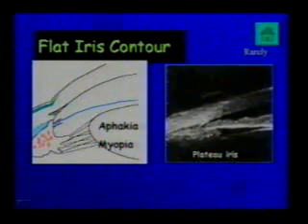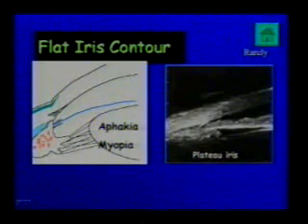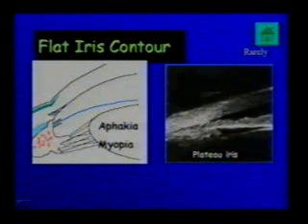In this condition, we have the ciliary processes thickened, pushing everything forward, pushing the iris forward, and the angle is narrow.